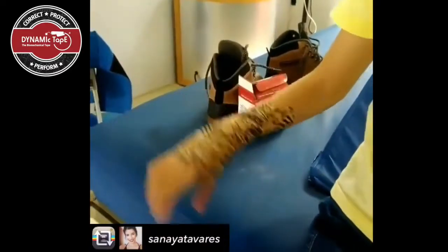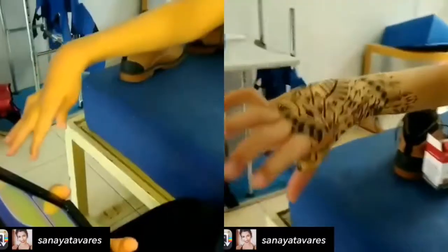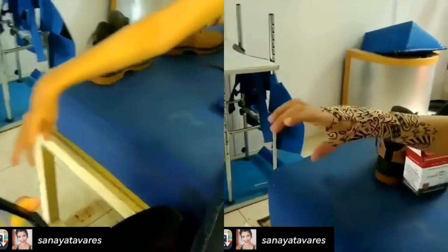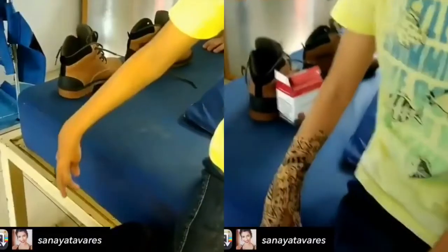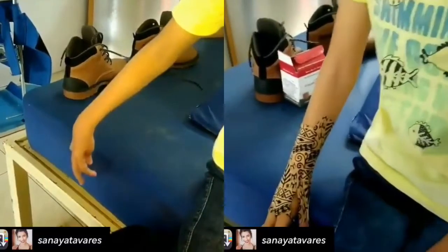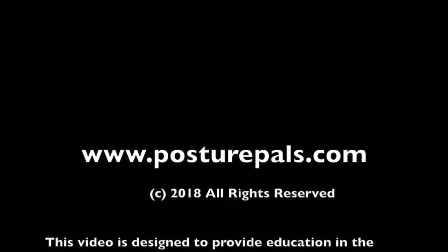Here we can see that elbow bending in that case. So again, we just look at the change in the resting position — that thumb positioning out and that wrist creating some extension. They're using that strong recoil of the tape, and that translates to improved position and ability to get some weight down, stretch out through those flexors, and get a little bit of wrist extension as well.